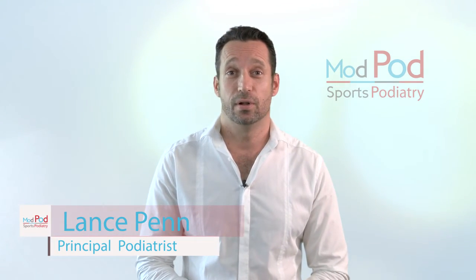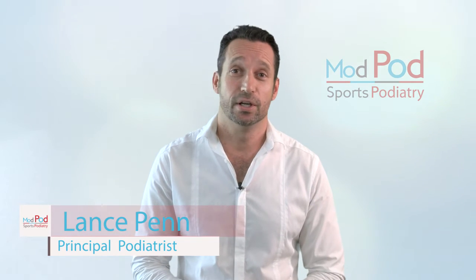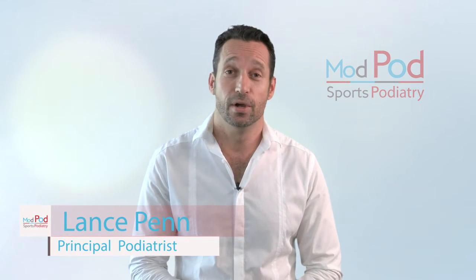During the process of treating patients with low-level cold laser, you can actually wear nail polish. We tend to discourage it though, because you want to keep the nail open. We don't encourage women to wear nail polish because nail polish actually does damage the nail plate, and that's going to be one of the factors contributing towards their fungal infection. We're not opposed on certain occasions. If you've got a function, definitely put nail polish on, but do not leave it on for more than a couple of days and take it off.